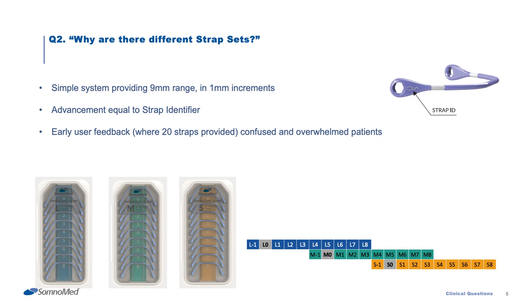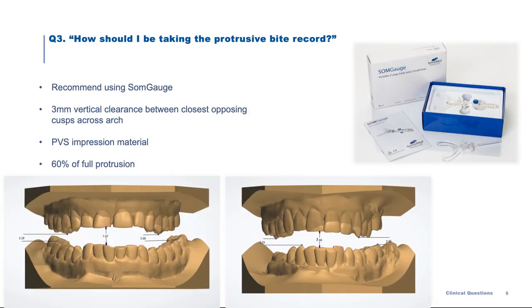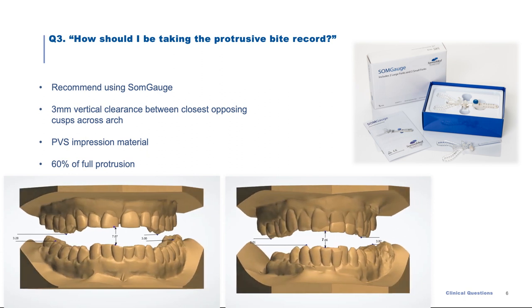Therefore, SomnoDent Avant is supplied with a small, medium, or large set of 10 straps, providing a total range of 9mm. Advancement from the supplied bite record matches the strap ID. Additional strap sets are available where straps need to be replaced or a patient needs to transition to another strap set. How should I be taking the protrusive bite record?